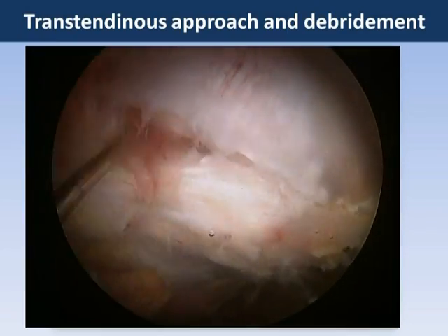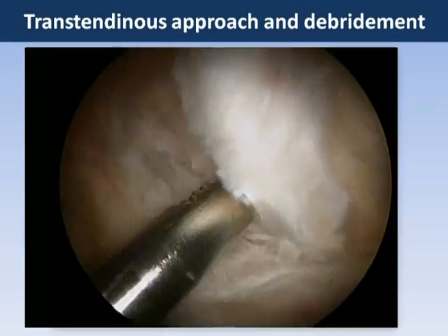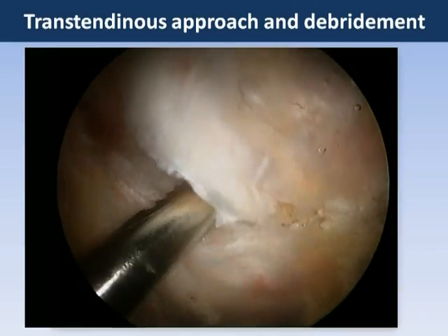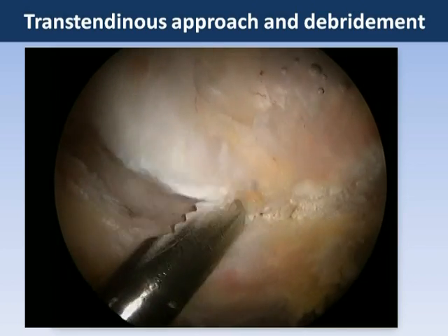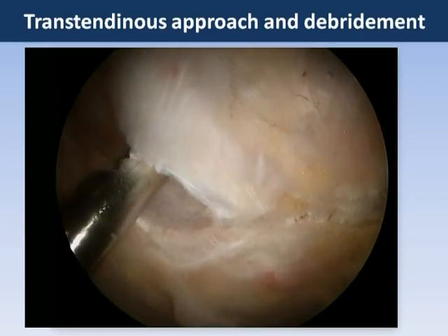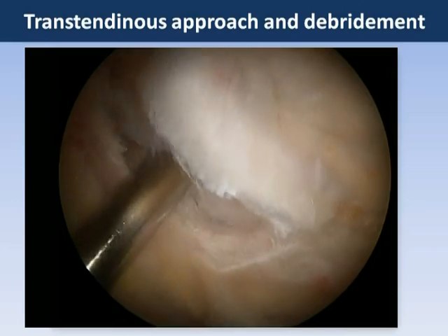This is analogous in many ways to a partial thickness undersurface tear of the rotator cuff, or another analogy would be lateral epicondylitis, where there is degeneration of the deep fibers of the tissue. Here we perform a debridement of those degenerated and pathological deep fibers where the tendinosis and partial thickness tearing lies.